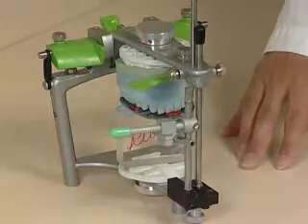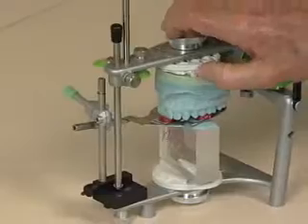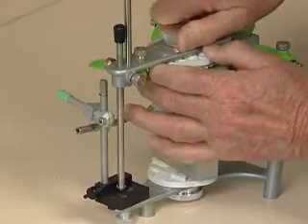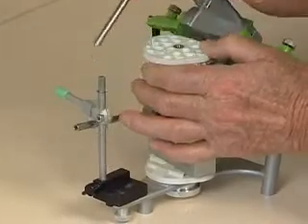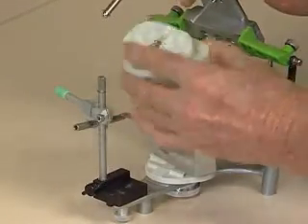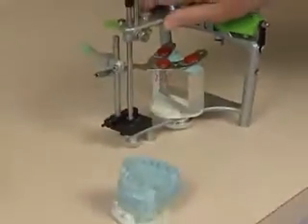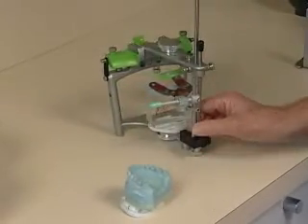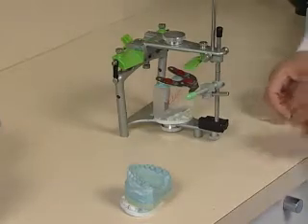Quite frequently, what I do to open it is that once I know my mounting stone is hard, I actually loosen the model and open the articulator, and now I can lift the model out. That way I know I'm not going to break off any teeth. And now once we have our upper model off for the moment, we can take off our bite fork and everything.